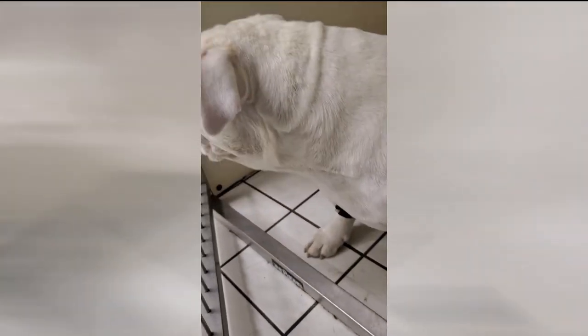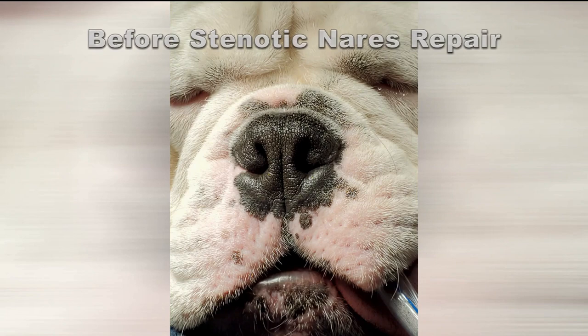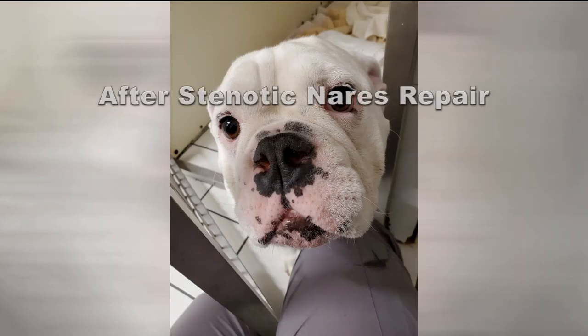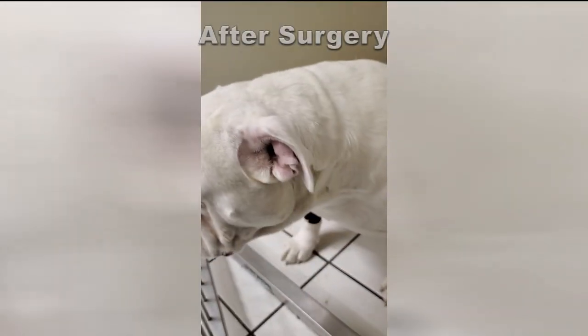Now this dog also had the stenotic nares repair as well, so we're going to go on and take a look at that also. There's the before of the stenotic nares — you can see the pinched nose. This is where we're looking, so this is before surgery.